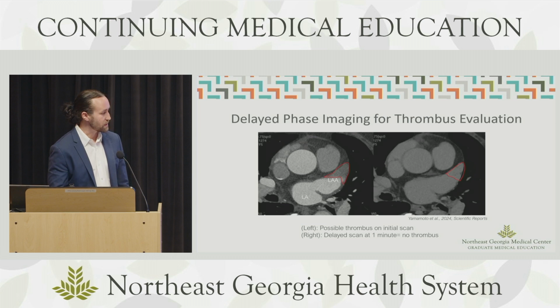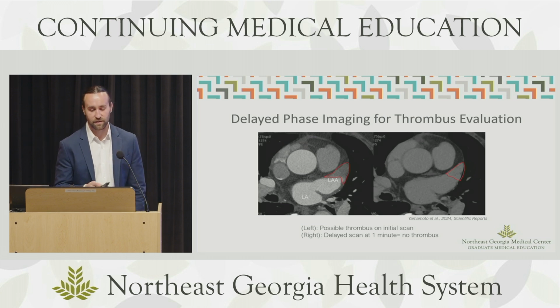So typically, the standard protocol, which we do at this hospital and which is done by a lot of studies, is a 1 minute delayed study. You do your initial scan at 0 minutes, and then you repeat a scan anywhere from 45 seconds to a minute, to allow the contrast to completely opacify the left atrial appendage.